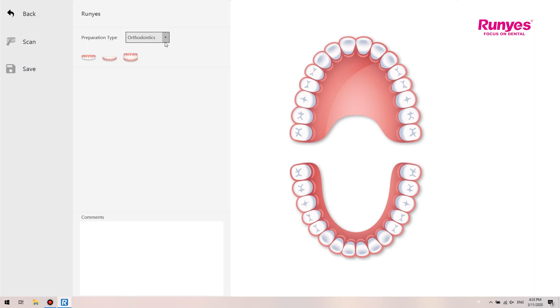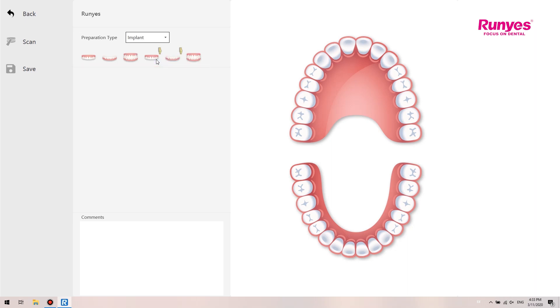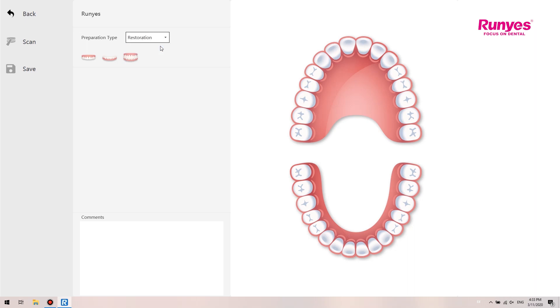The scanning process of implant is upper jaw, lower jaw, occlusion, without scan body, with scan body, and finally select whether to scan the occlusion again according to the situation. It is recommended that users select the scanning method according to their actual needs.